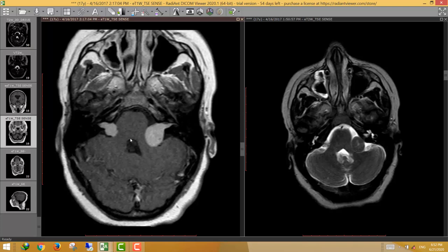The other stigmata of neurofibromatosis type 2 include multiple schwannomas — especially cerebellopontine angle — multiple meningiomas, and in the spinal cord, ependymomas. This patient did not have an MRI spine, so we should look for meningiomas along the dural surfaces.